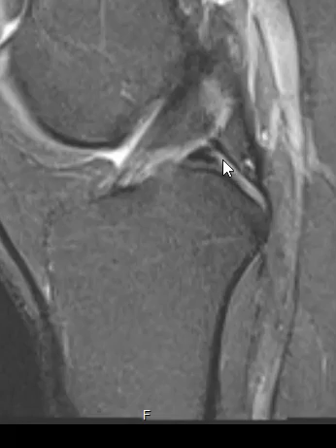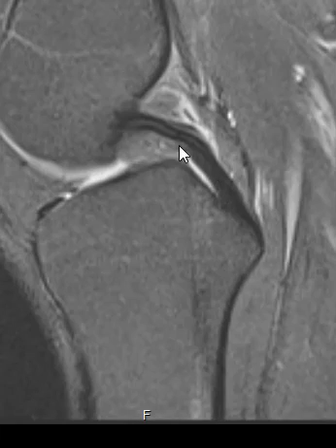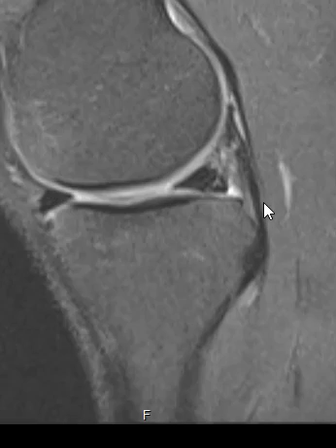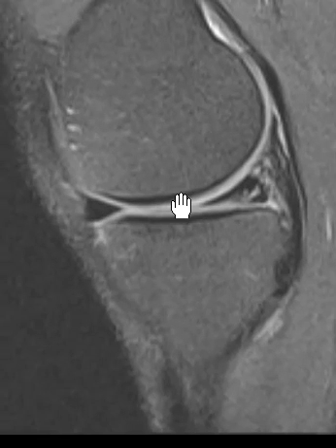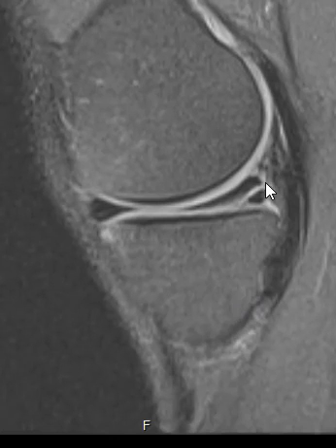Now we're going to jog across the middle — here's the anterior cruciate ligament, posterior cruciate ligament — now we're going to come out the other side. As we come out the other side, we notice something is wrong on this one. This is where the tear is.